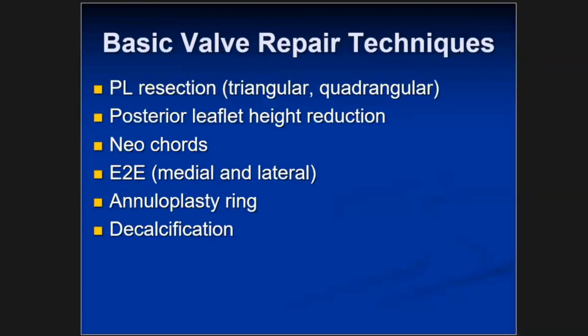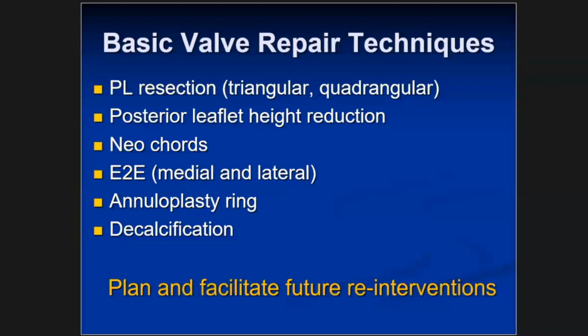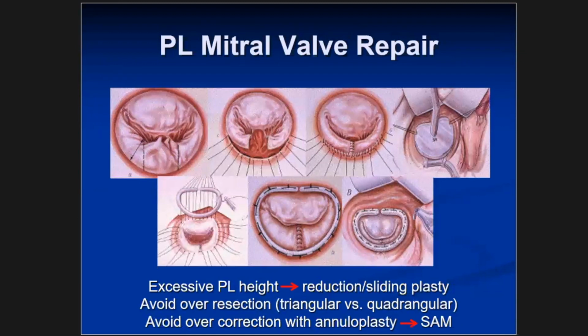So again, we're going to talk about the basic valve techniques in a moment, but the key when we think about all those repairs is to really think about long-term therapies in the life of a patient, a lifelong therapy, and to keep in mind future reinterventions, including transcatheter therapies. So the most basic repair, and I just wanted to go with this group, and I know there's mostly cardiologists in this group, is to talk about repair techniques themselves and how they apply. This is the basic foundational repair that every surgeon that was trained in this decade should be able to do.